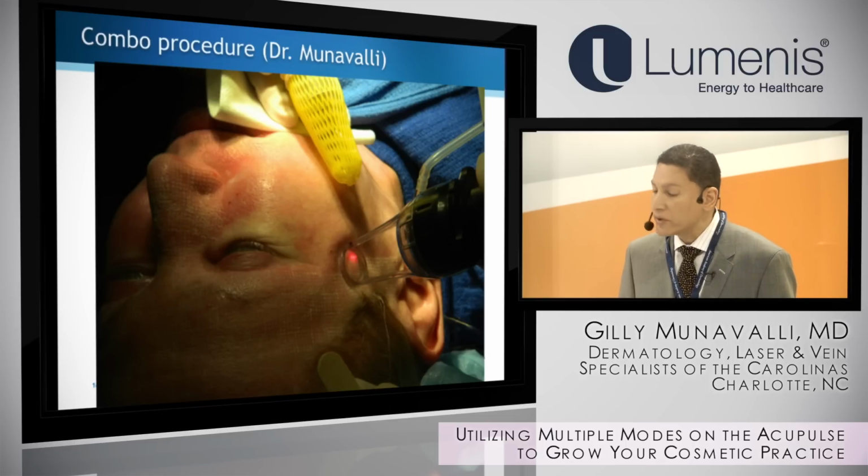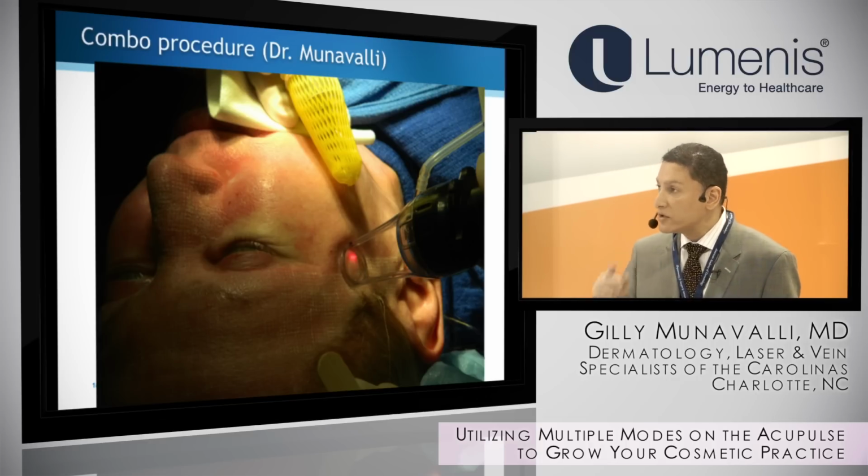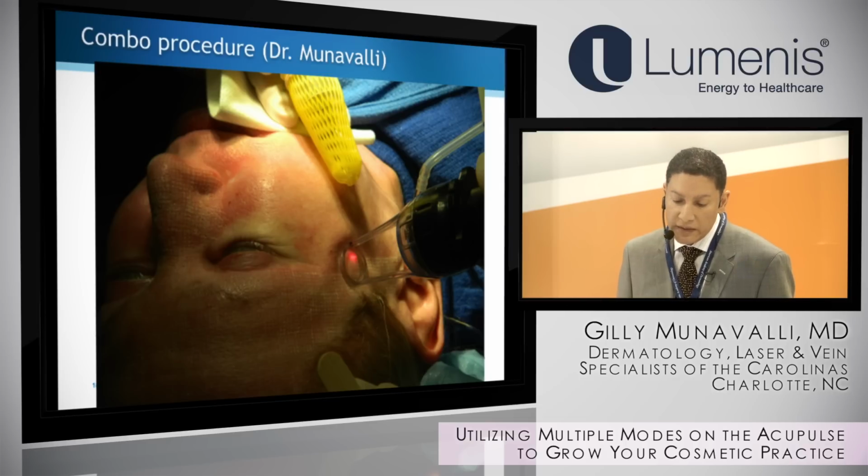We typically do this with a smoke evacuator, and we usually use local anesthesia. It depends on what we're doing, with some IM sedation. You can see the eye shields in place, so we can go all the way up to the preseptal orbicularis, and usually a full treatment can take 45 minutes to an hour, depending on the numbing and how the patients are tolerating the procedure.